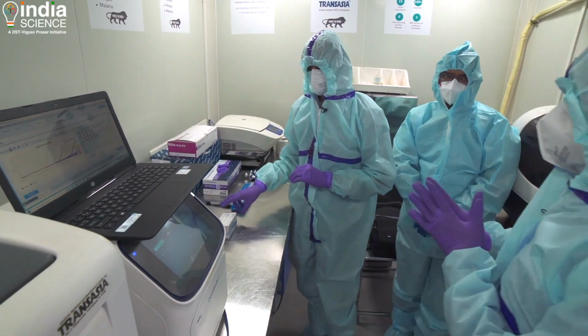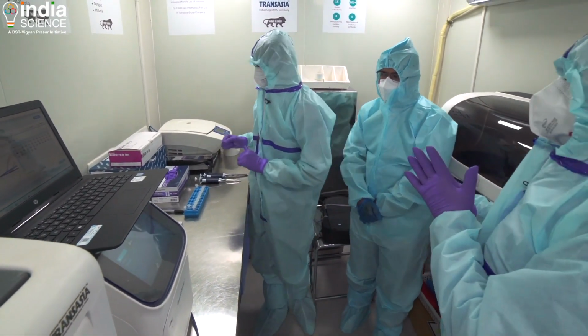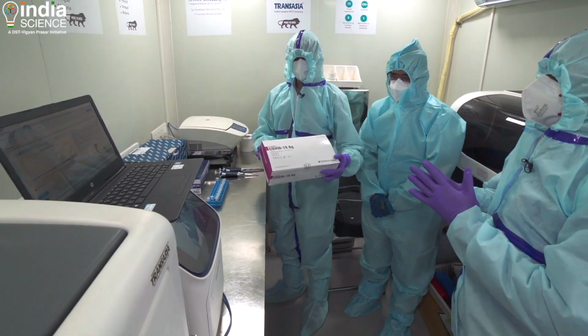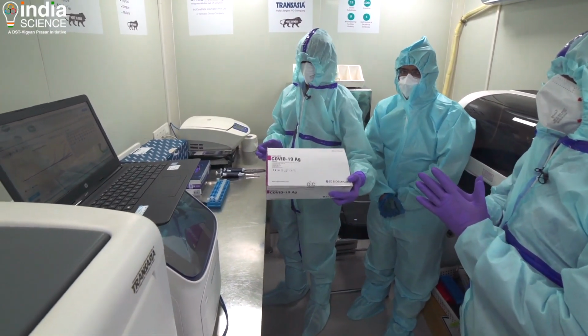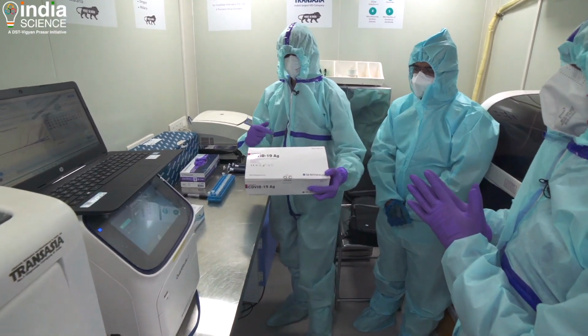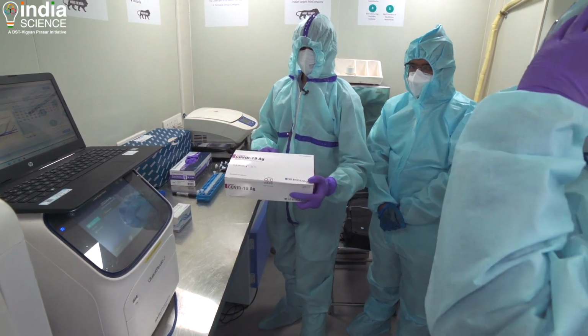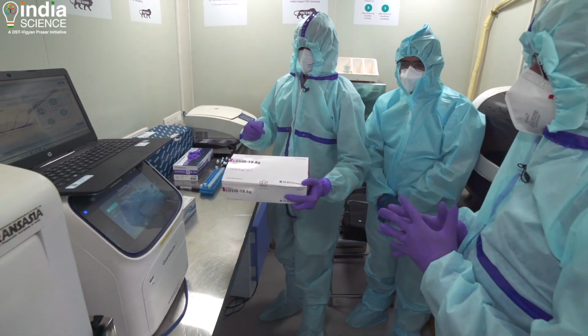There is another way of doing testing, which is using the rapid kit. This is the rapid antigen kit that we are using currently. This is the antigen test, which is much shorter, and as it says, it is rapid. It takes about 15-20 minutes from the time you collect samples to get results here.